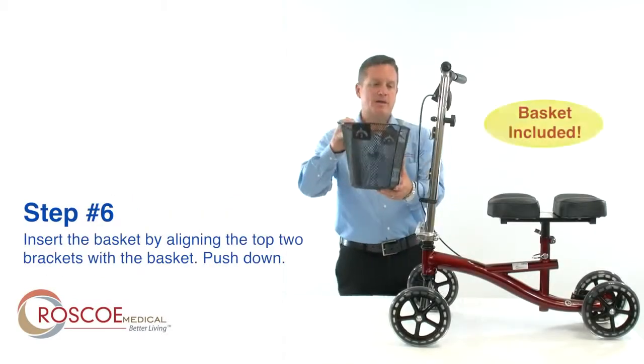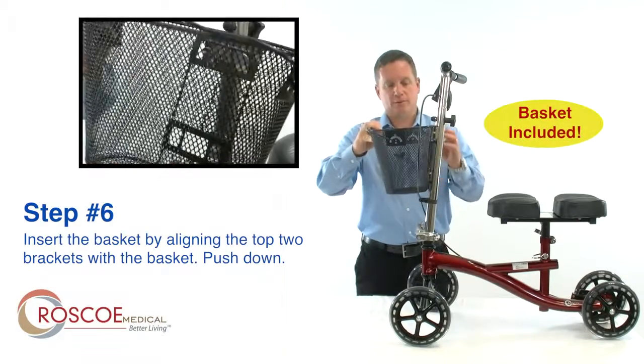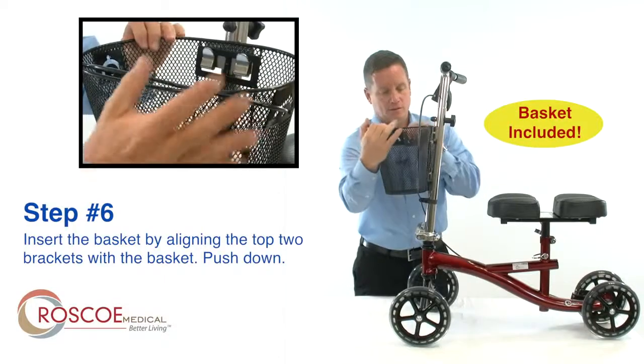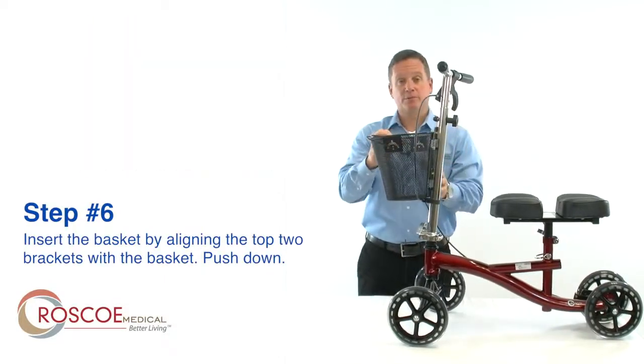Step 6: insert the basket. Simply align the top two brackets with the basket and push down, securing the basket in place.